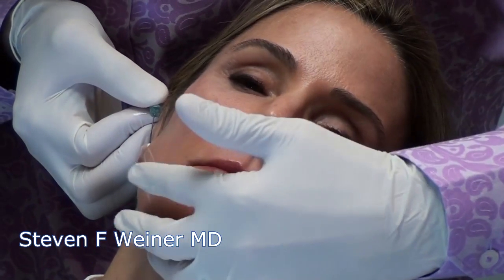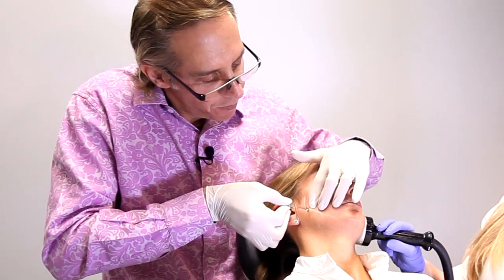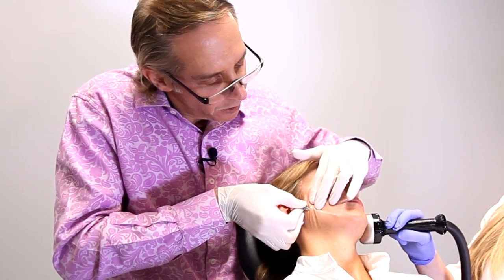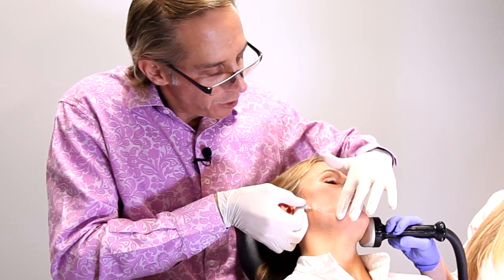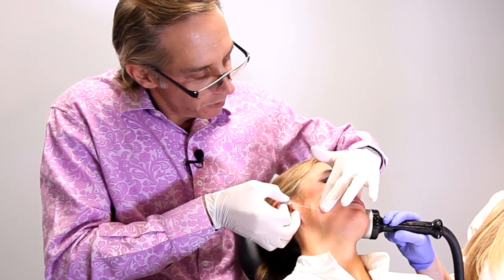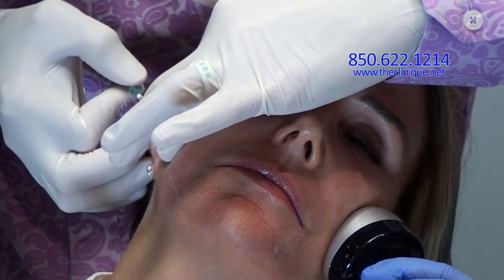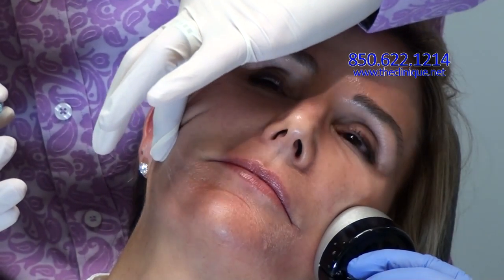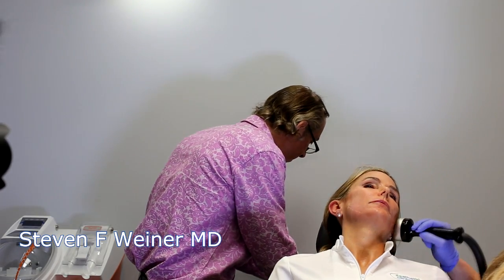and then you gradually milk it down the skin. See, she has very little discomfort here. And you take it to the marionette area. So that's placement. And then I gradually withdraw this, and I'm engaging the barbs as I'm withdrawing. And there you have it. So this thread is in, and it's engaged, and it's pulling the side of the corner of her mouth and the marionette. We'll do one more. I didn't feel that at all. Awesome.